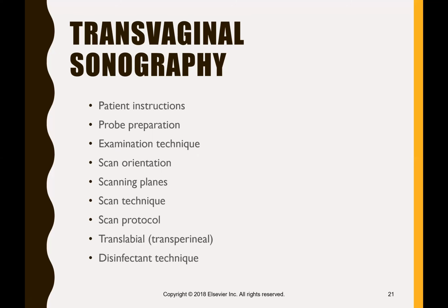Some places even require that you do both scans. Where I work, PRN still, we usually just do the transvaginal because it's most of the time a better image. If I can't see everything, then maybe I'll do the transabdominal. Some places start with the transabdominal. If they get everything, they're done. So it just depends on what your clinical site does.